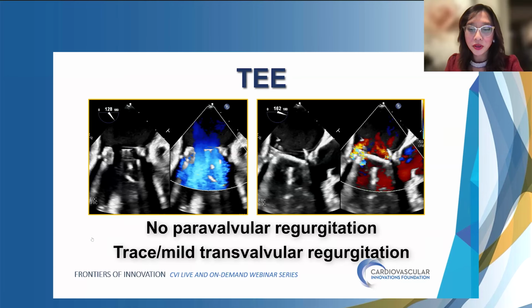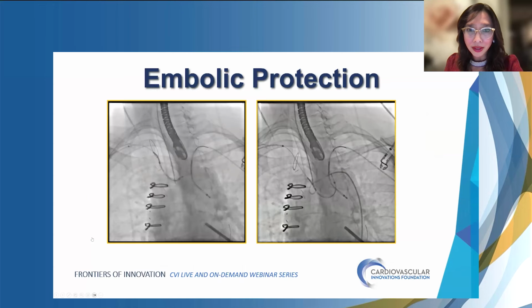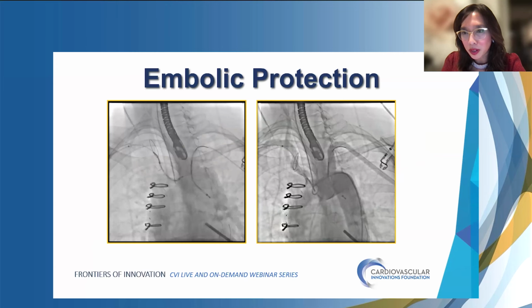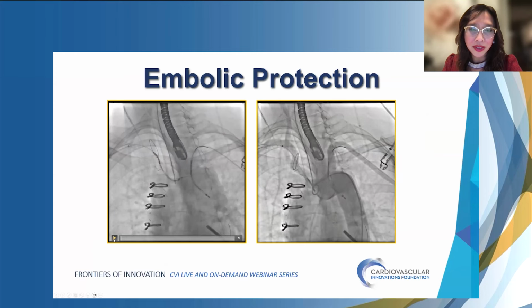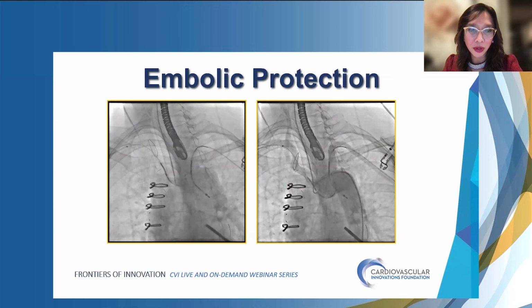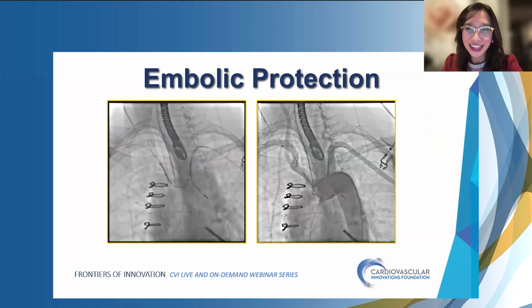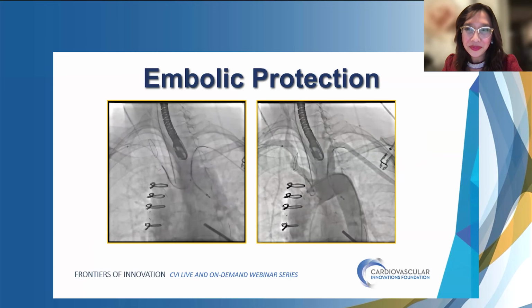All right. So absolutely, we went for PMA, next slide. And in terms of the steps, what is the next step? I think with his recurrent stroke, embolic protection would obviously be the first step of the procedure, which I'm sure Abdullah and Sanjam would agree. And there were some difficulties, Paul, I remember, when you were trying to insert the Sentinel device. Would you like to comment on what you see here?